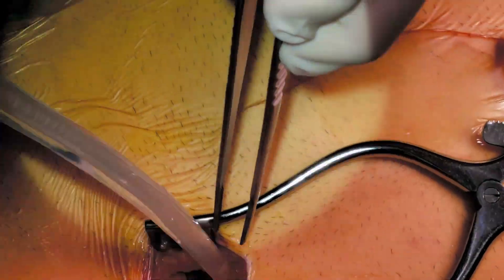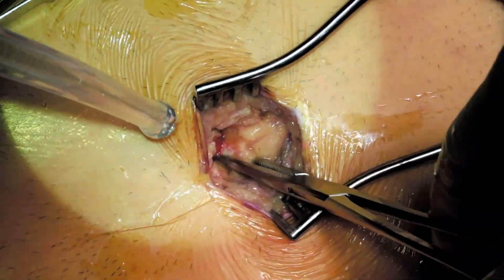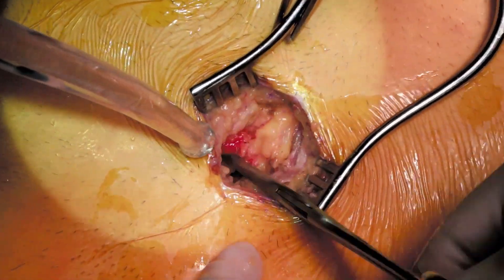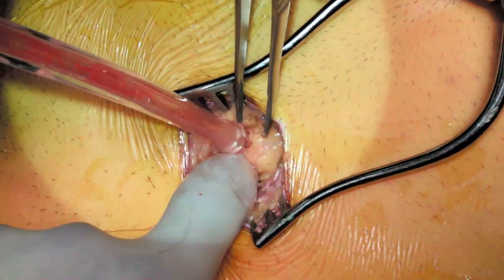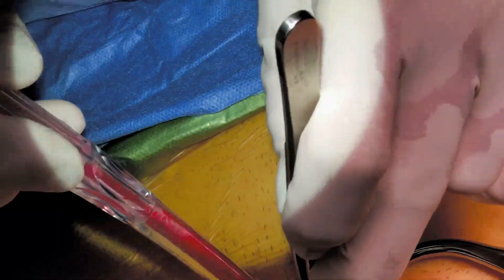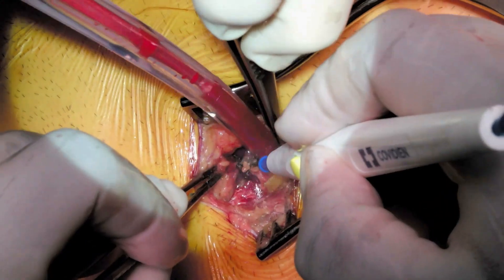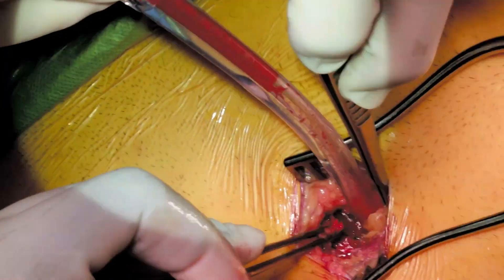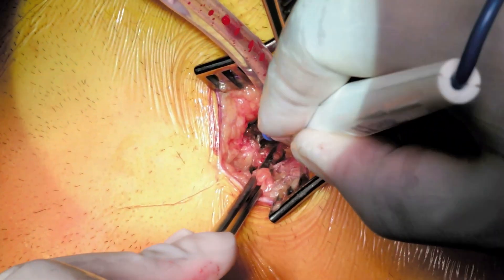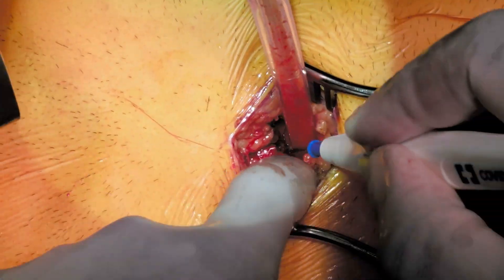I've grasped the xiphoid process with an instrument referred to as a Kocher. Usually once I identify the xiphoid process, I like to grab it and resect it in one piece, but in this case I was having difficulty, so you're seeing me resect it in multiple pieces. When you take out portions of the xiphoid — which is bone — it can sometimes lead to bleeding, so you'll also see me stopping the bleeding with the electrocautery.